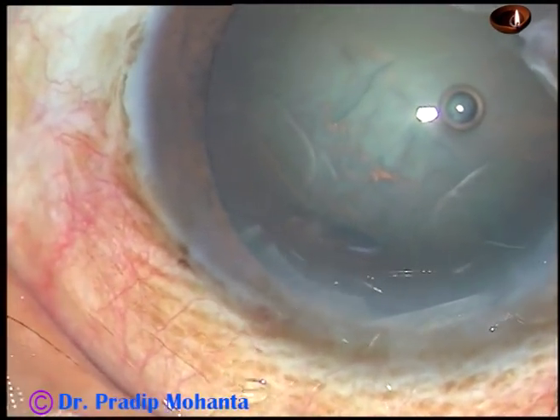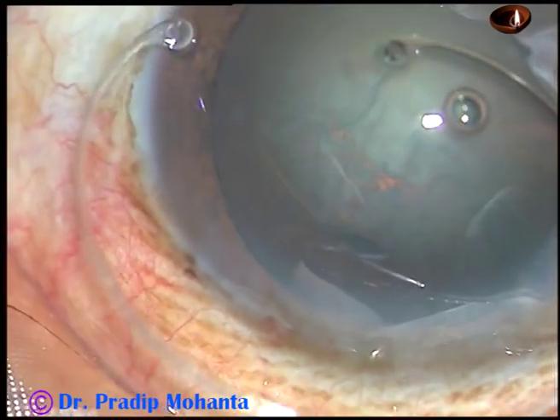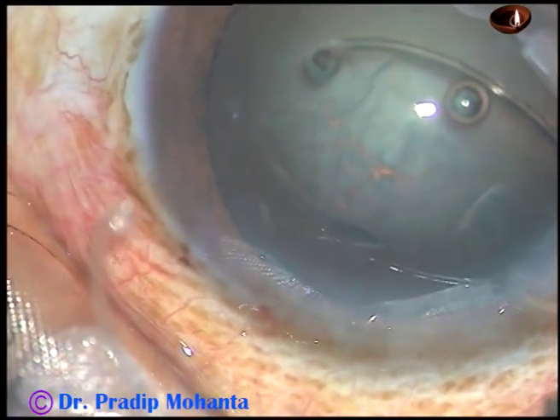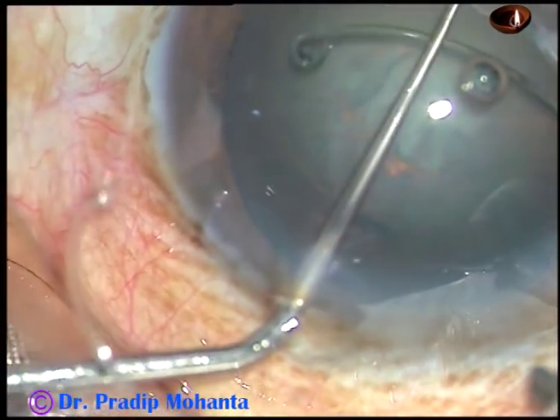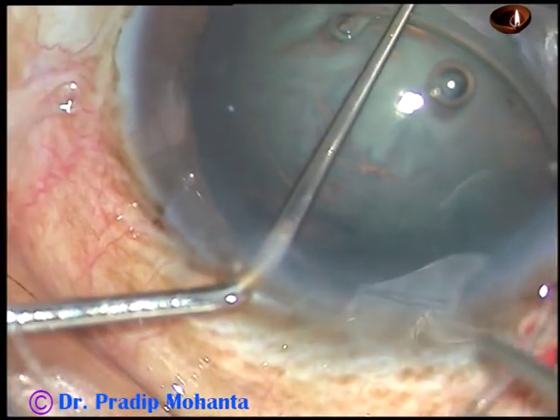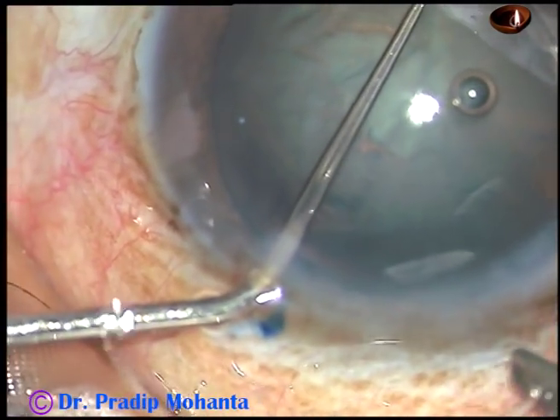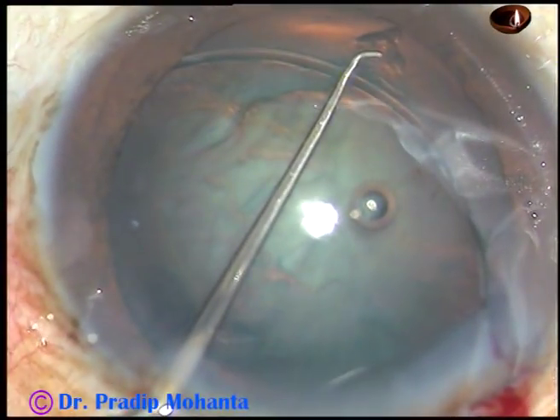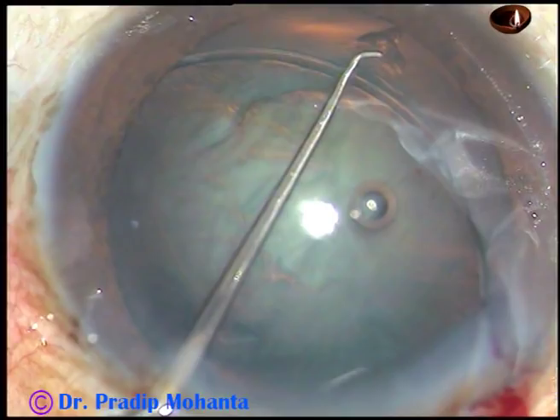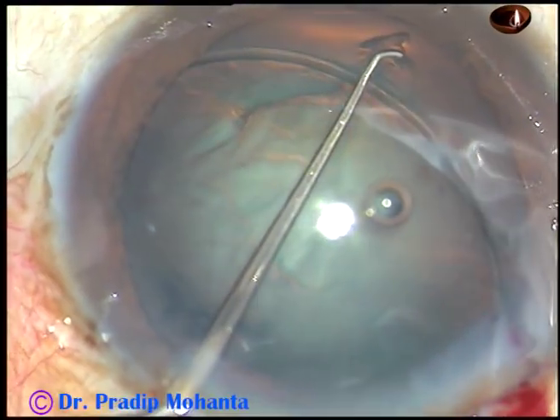Here it is — the capsular tension ring is introduced. It doesn't tend to go into the capsular bag, so what I do is introduce the Sinskey hook over it. The Sinskey goes underneath the anterior capsular rim. Now this CTR has no other way — it has to go into the capsular bag. The Sinskey hook is underneath the anterior capsular rim and the CTR is being pushed into the capsular bag.